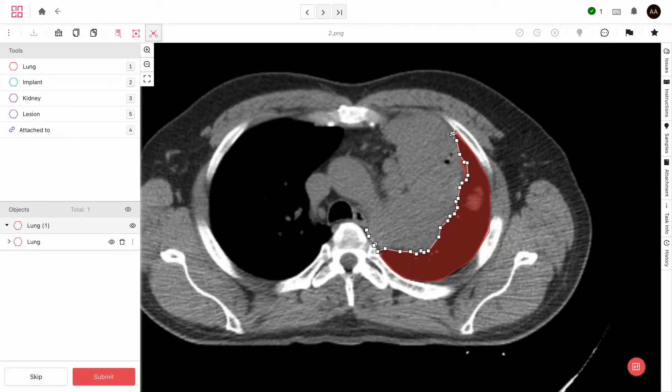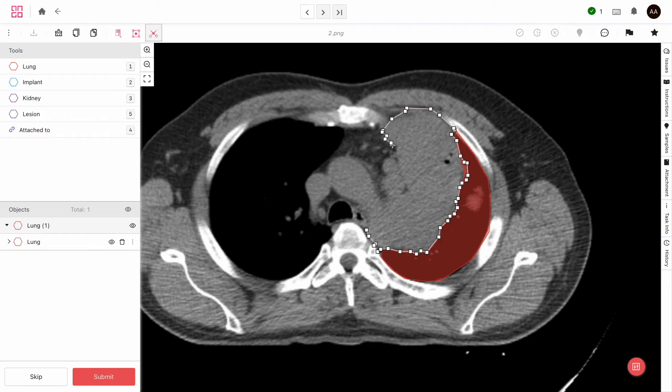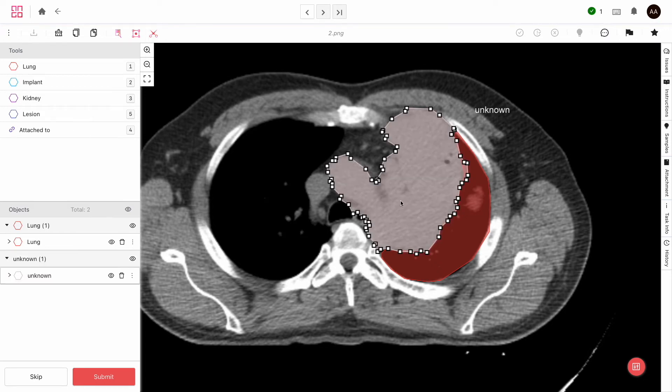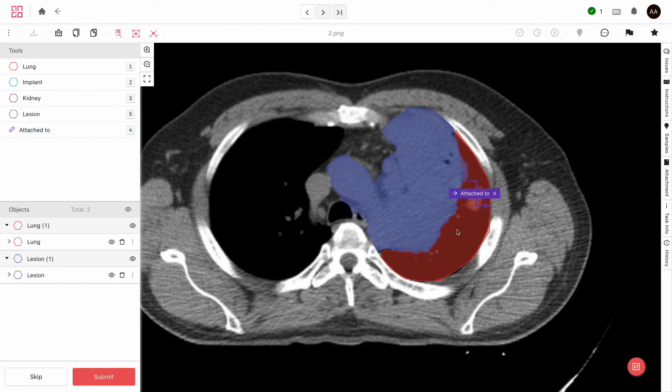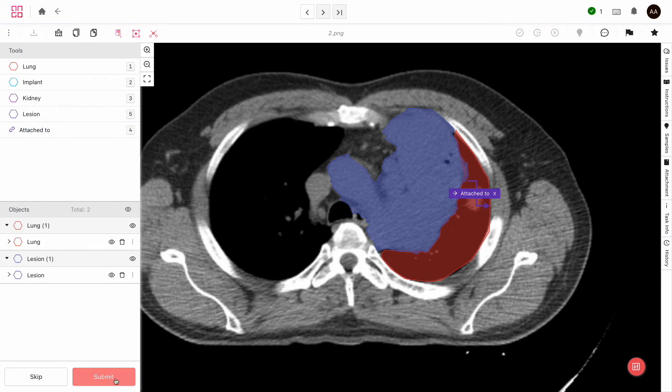Let me show you something else you can only do in Englehub. If we add a relation to our categories, we can link different labels together. For example, here you can see this white mass is attached to this lung. It looks like some sort of lesion. If we label the lung and the lesion, we can then link them together using the relation tool like so. Your machine learning model may benefit from the extra information relations provide.